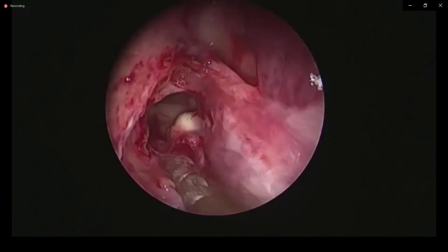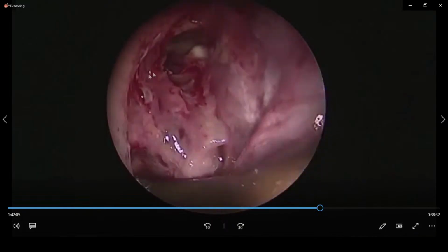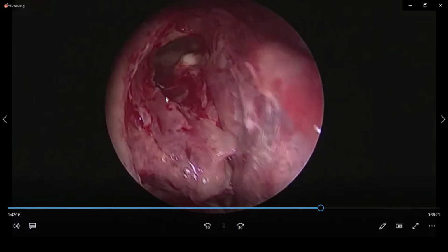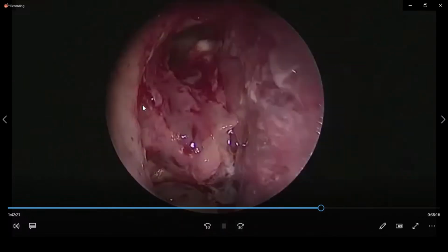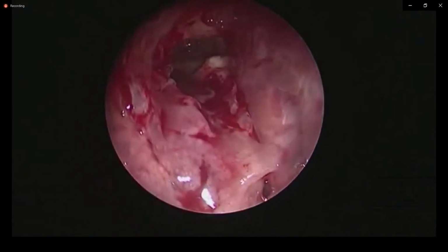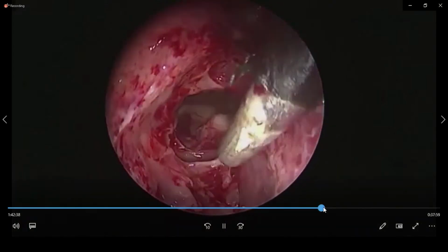So still we are in the frontal sinus work. Still more frontal sinus work is required to be done. See, the bulla is intact still. The beauty is, as long as bulla is intact, we are not bothered about the anterethmoidal artery. This bulla is going to the skull base there, anterethmoidal artery is behind. So intact bulla technique offers you the opportunity to protect your anterethmoidal artery getting unnecessarily damaged by the surgeon. See that? That's the panoramic picture of the frontal sinus.